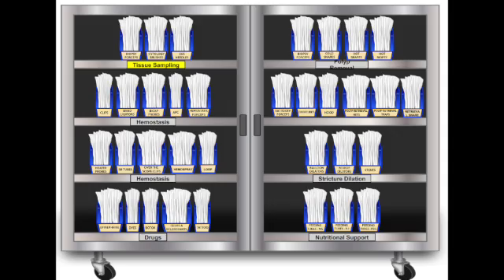Yes, overtubes can be used. A large tube placed over the endoscope can help retrieve larger foreign bodies or facilitate multiple scope insertions. And rat tooth forceps, strong grasping forceps, also used for foreign bodies and sometimes removing stents. Okay, nearly there. Let's wrap up with tubes, dilation, and stents.